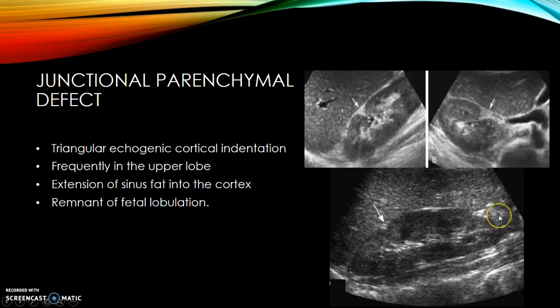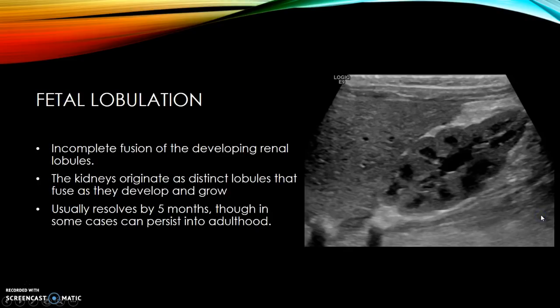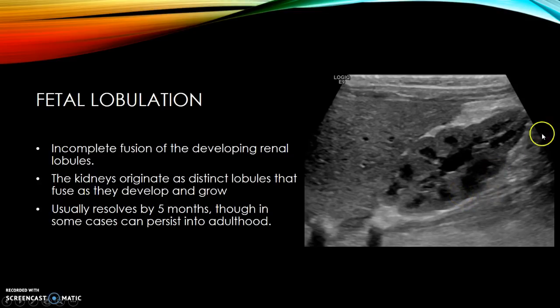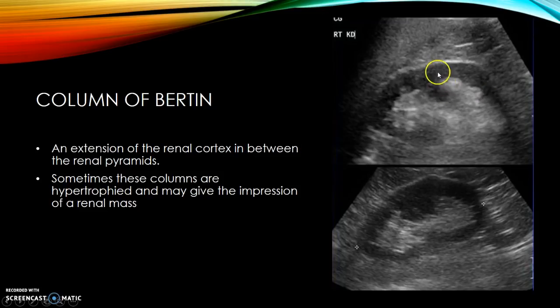There are many normal variants of renal anatomy. The first and very common one is a junctional parenchymal defect — a triangular-shaped echogenic structure that is an invagination of sinus fat into the cortex, frequently seen in the upper lobe, and a remnant of fetal lobulation. Fetal lobulation is the incomplete fusion of developing renal lobules. The kidneys originate in the embryo with distinct lobules that fuse as they develop and ascend. This usually resolves by five months but can persist into adulthood.